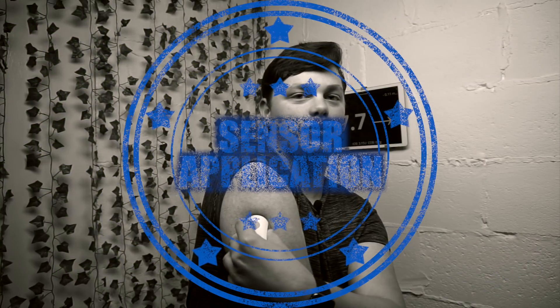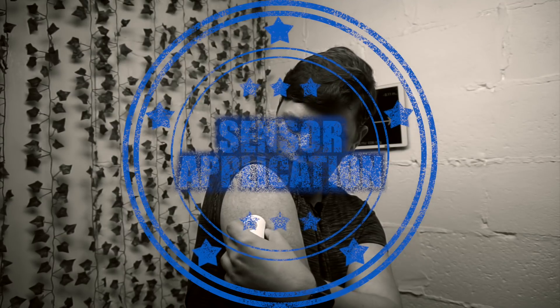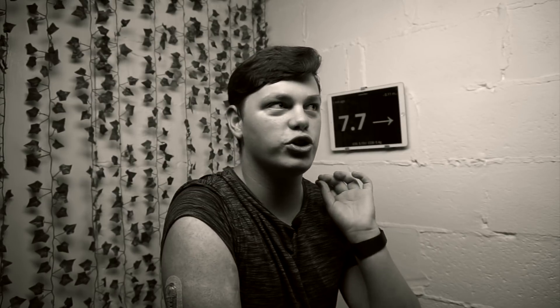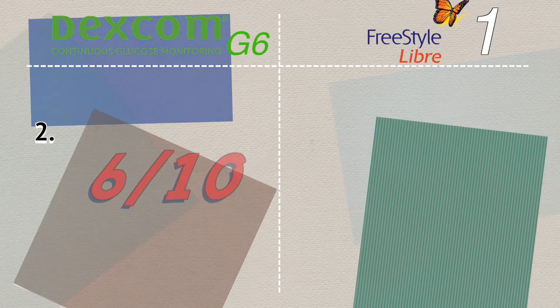In a nutshell, they're both very accurate. Category two is sensor application. Dexcom claims G6 application is painless — I would somewhat disagree. It is very different to the Freestyle Libre application. The G6 needle goes in at ultra-high speed and you can definitely feel it entering and leaving, though it happens very quickly. I wouldn't call it painful, but it is strange. So Dexcom G6 sensor application gets 6 out of 10.